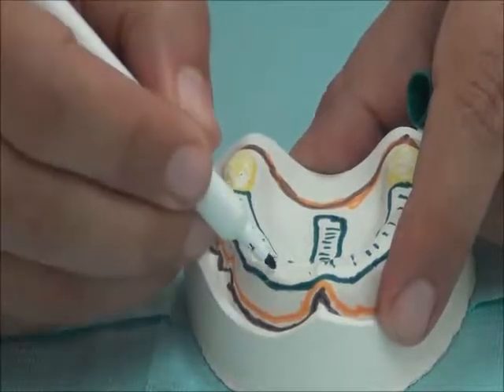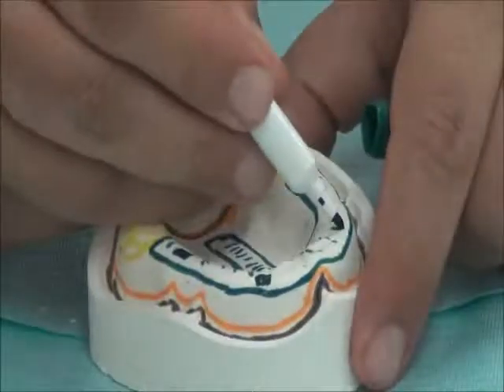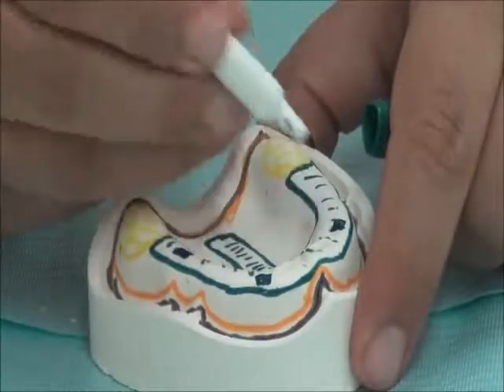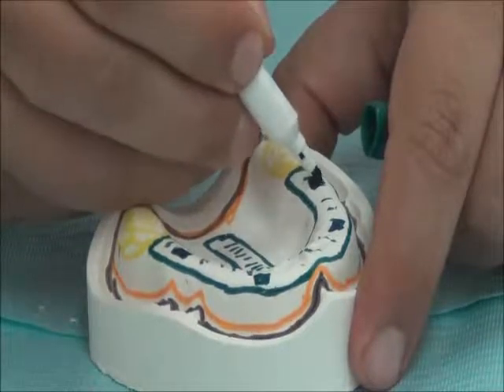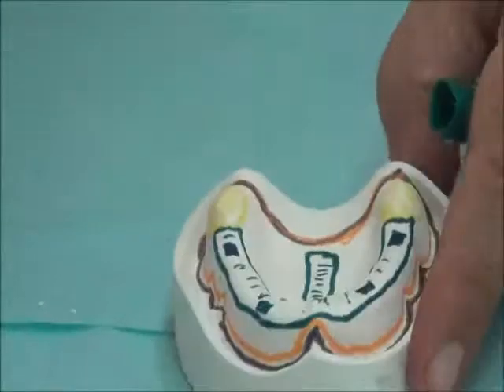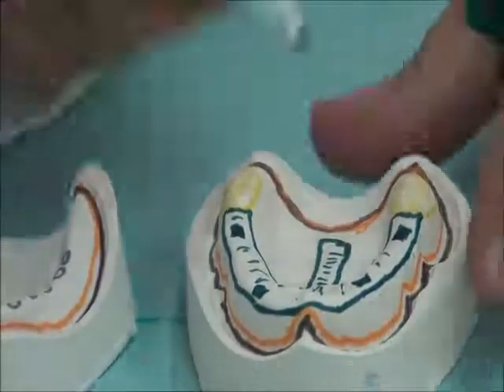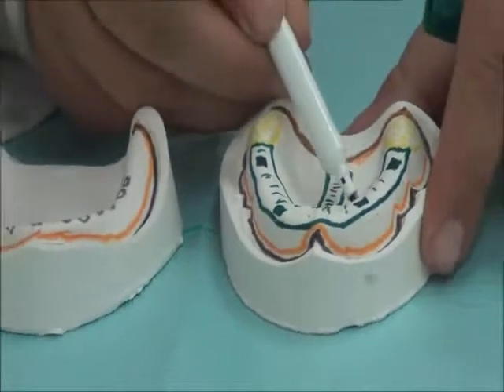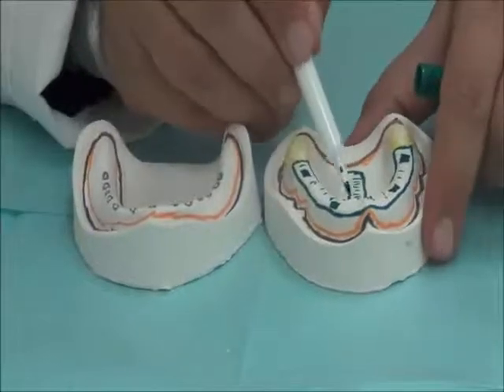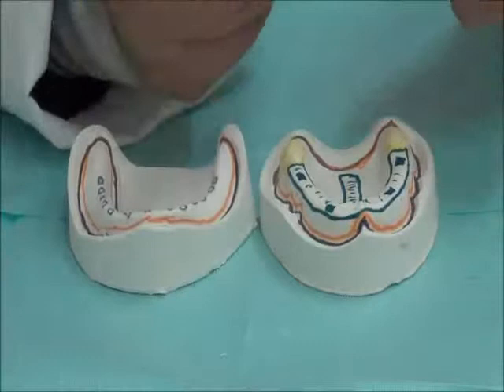2 in the posterior area and 2 in the canine area. So these are stoppers. Now you're ready for the step where you're going to draw the outlines and then consult with your supervisors and helping staff with the outlines that they are sufficient for the purpose. You have 10 minutes to do this.